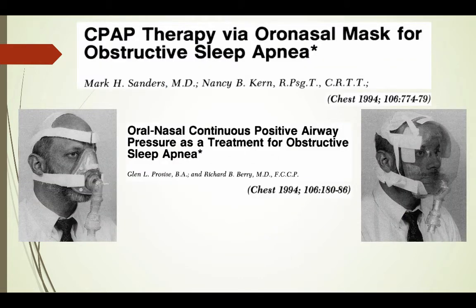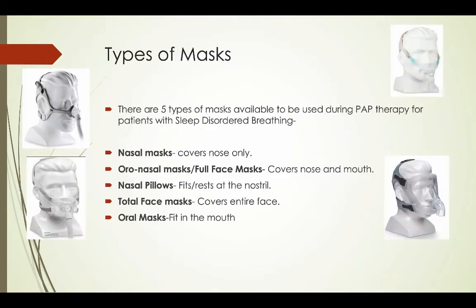Then in 1994, almost 15 years later, the oronasal mask and full face mask came to be shown as effective for treating obstructive sleep apnea. And you can see that the designs were quite bulky and you needed a lot of straps to fix these masks onto the patient. And definitely these look quite uncomfortable.